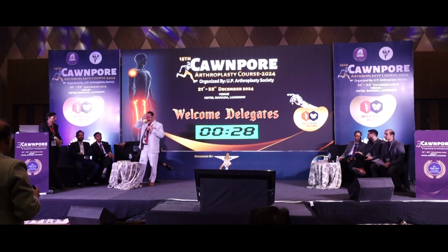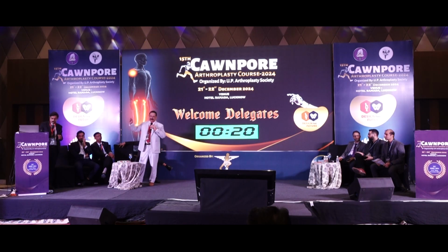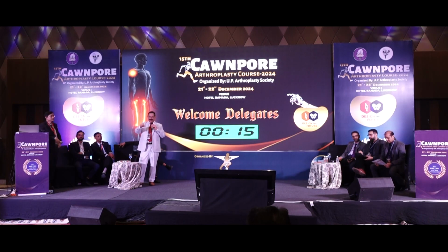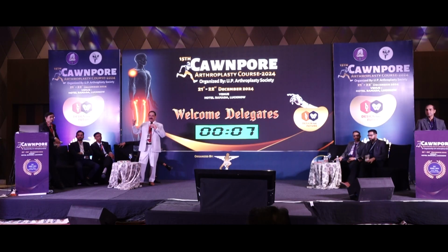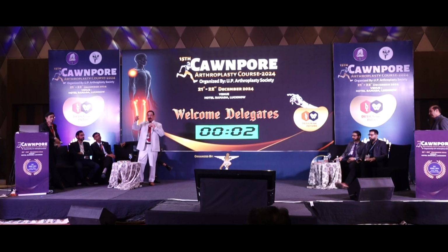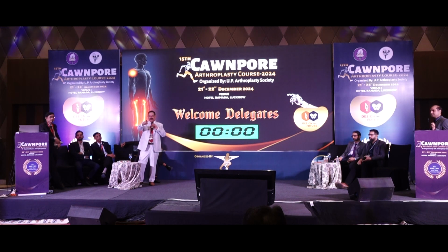For rehabilitation, a lot is guided by the primary stability you got on the table. Suppose, as Vijay has told, you are putting an augment which is contributing to the stability of the cup, your rehabilitation will be slow. You'll be giving partial weight bearing depending on osseointegration. Now, if you have used the augment just as a filler instead of bone, and there is primary stability of the cup, then you're not worried much about it. Then you will not modify it. So that was your first question. Second question was LLD.